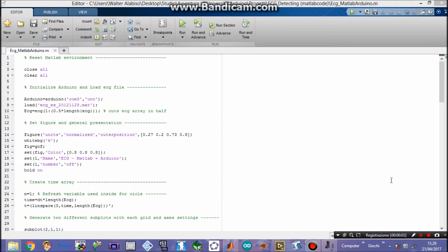Now I'm going to explain the code. First, we need a few steps involved in correctly initializing our environment by closing any figure and clearing any variables. Then we create an Arduino variable and we load the ECG file that is stored in memory.